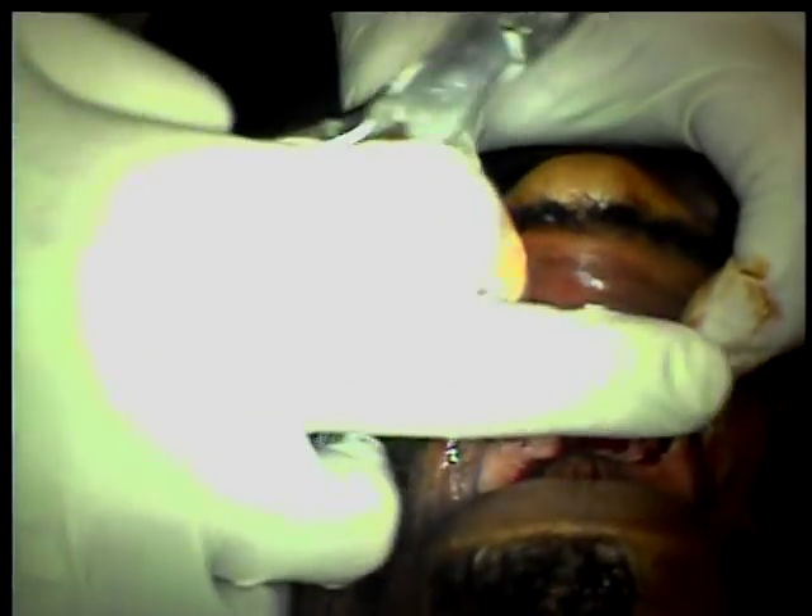Now I'm going to go back and smooth your gums up, because if I don't, all this bone will hurt with your denture. Okay.